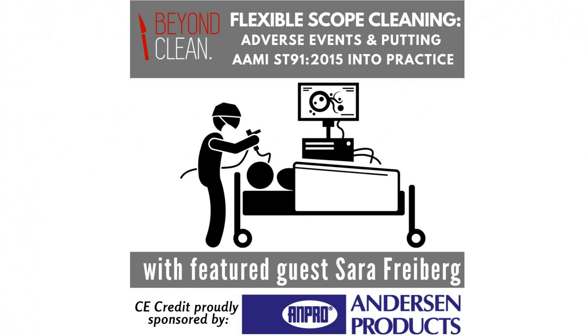Well, the importance of endoscope leak testing is crucial from both a patient safety perspective as well as an economic concern. Flexible scopes are meant to remain dry. So if we miss a leak from either a cut, a puncture, or a worn O-ring, and the scope enters into the patient, cross-contamination and patient infection may occur.